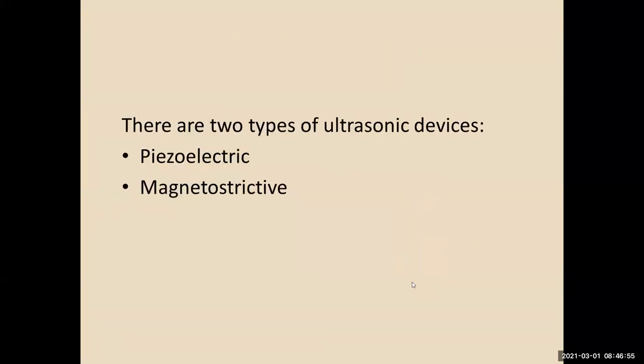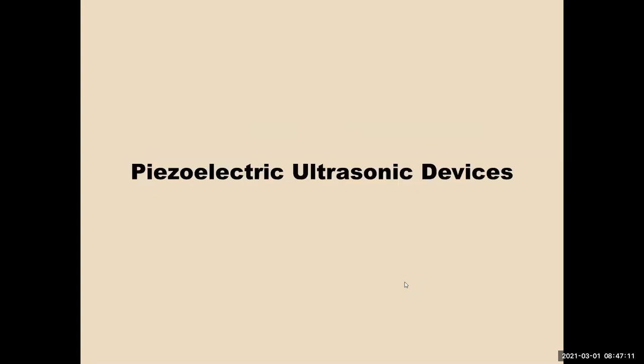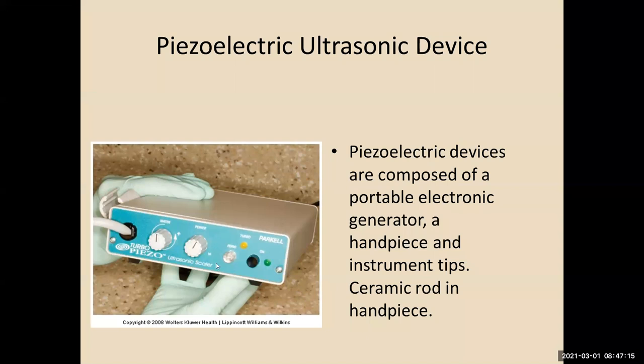Versus ultrasonic, which is broken up into piezoelectric and magnetostrictive. Now, most of the world uses piezoelectric, or piezos. We in America use magnetostrictive because that's what we use and we get used to what we use. So let's take a look at the piezoelectric. Okay. This is a Parkell unit. That's a name brand. I've used Parkell in my former offices.